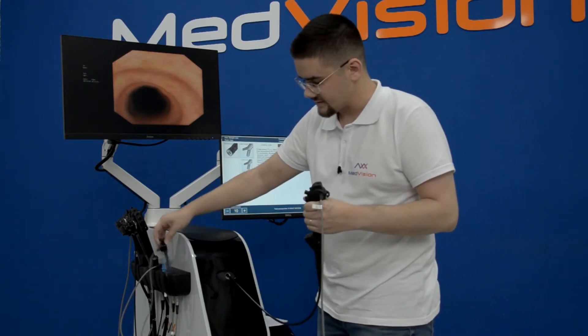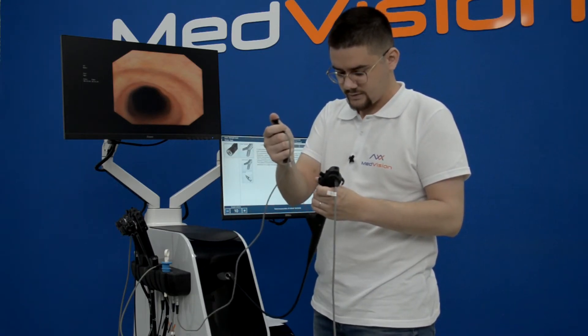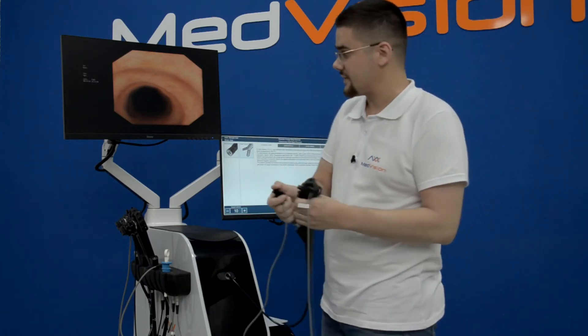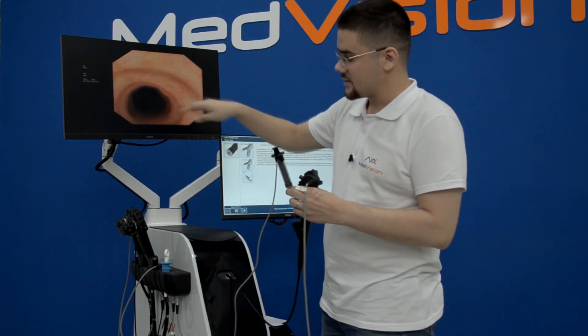The last instrument is the syringe imitator. You place it in and do the injection — that's it. You'll see some liquid coming out of the bronchoscope on screen.